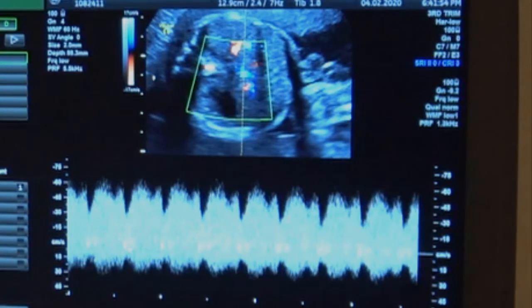And sometimes below, yeah. So would edema be a thing, like at nuchal, if we see an edematous nuchal, we'll often do ductus? Well, yeah, because you get edema because your cardiac output's not optimal. So that's pretty much just reflective of the fact that the baby has abnormal cardiac function, because most Downs babies do, they've got something going on. But I don't find ductus very useful in growth.